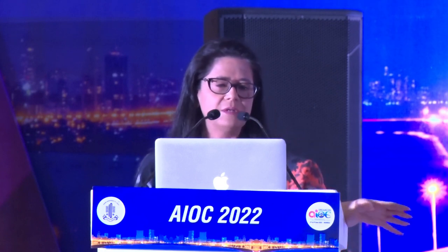The new kid on the block, a very popular lens by Alcon now, is Vivity. It works on a different principle of X-Wave technology. So here there are two smooth transition elements in the center zone of the pupil, and within this zone there is a 1 micron elevated plateau. So all this stretches your wavefront and shifts the light onto an extended focal length.